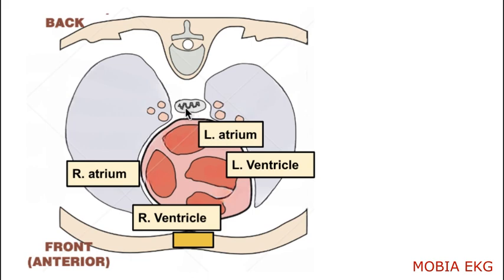As you see in this picture, the esophagus is located directly behind the left atrium. This anatomic relationship can be beneficial in cardiology. Most likely, especially my friends in telemetry have experience calling the cardiology unit to notify them about losing the EKG wave or disconnection, and healthcare staff responded, "Oh, patient went to TEE." What is TEE? What does TEE stand for?